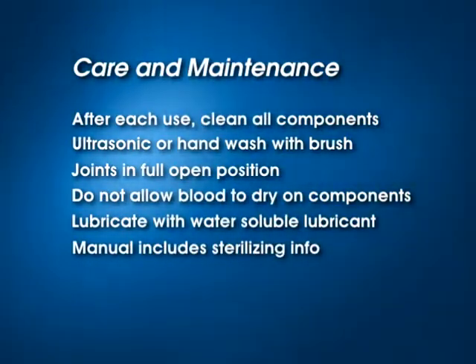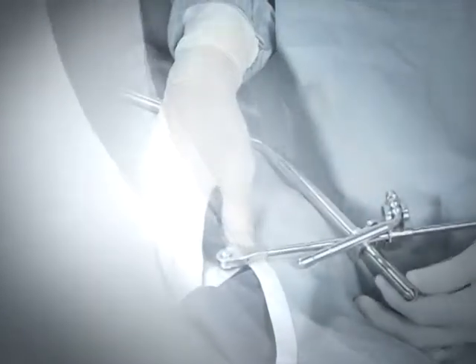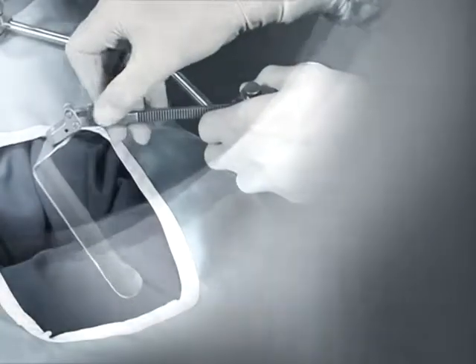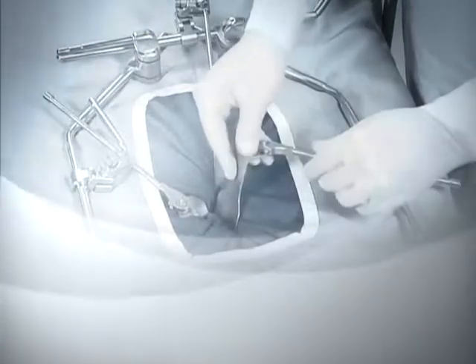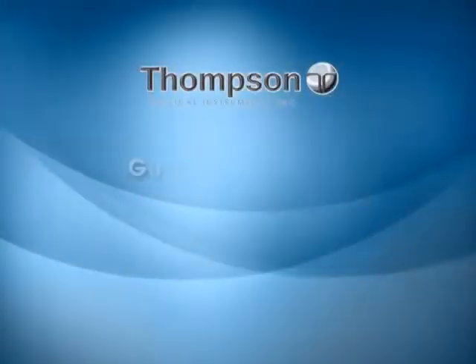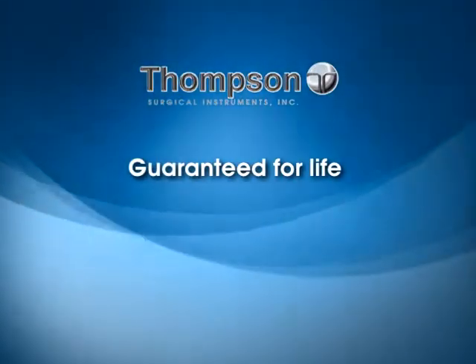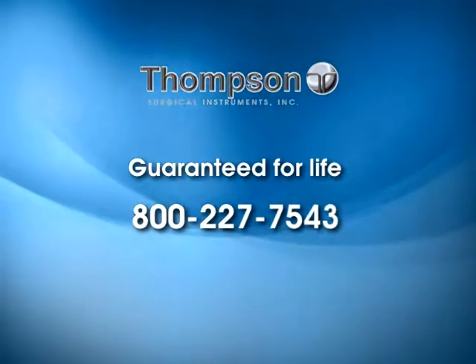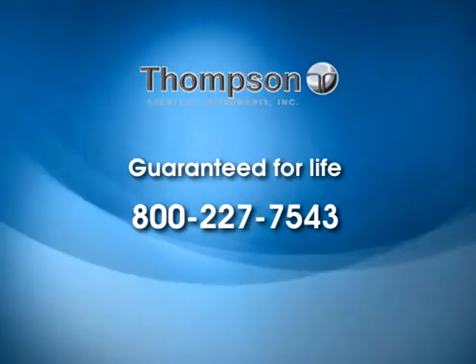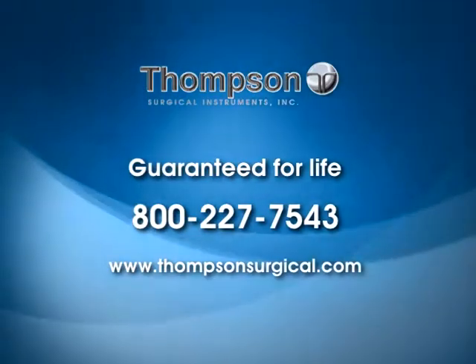Please refer to the manual for sterilizing times and settings. No other retractor system can match the power and versatility of the Thompson retractor system. From minimum access surgery to maximum access surgery, its unique one-frame-for-all-procedures capability saves the hospital thousands of dollars in retractor costs. All Thompson frame components are guaranteed for life against defects in materials or workmanship. For assistance, call 800-227-7543 or visit our website at www.thompson-surgical.com.